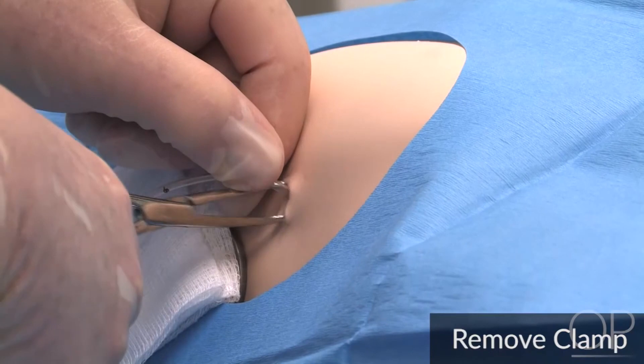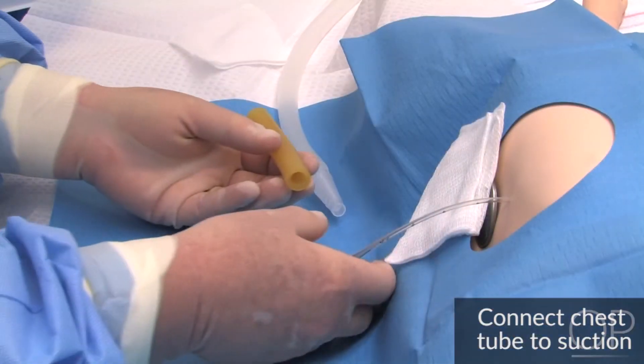Remove the clamp, being sure not to dislodge the chest tube. Connect the chest tube to suction.